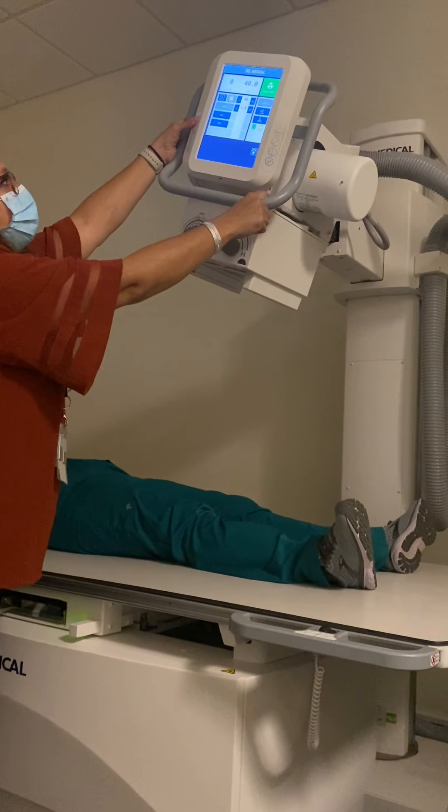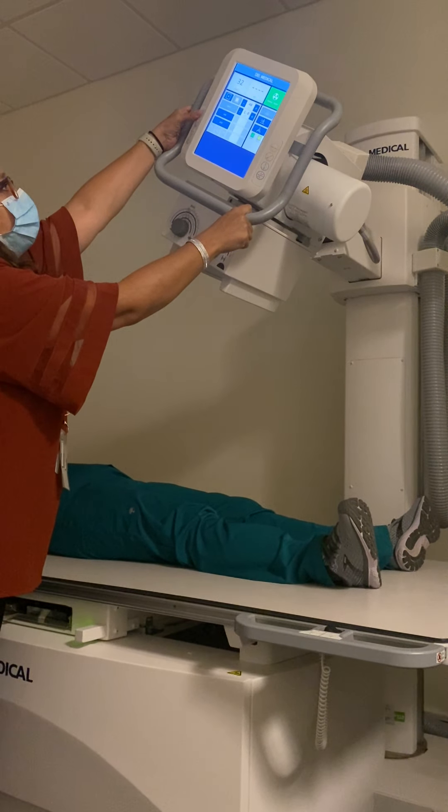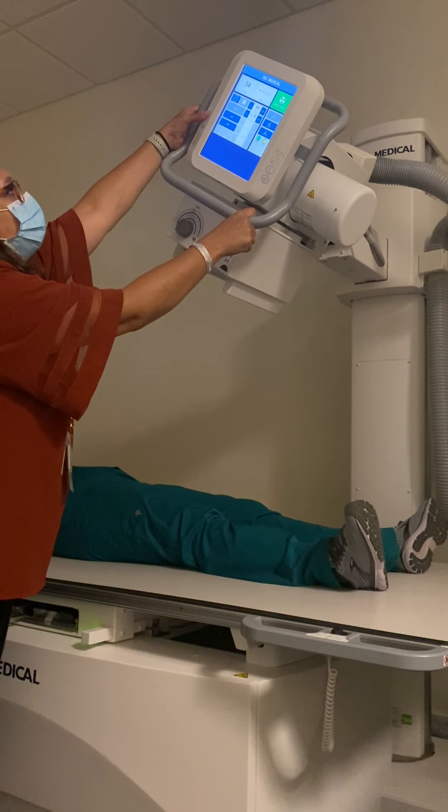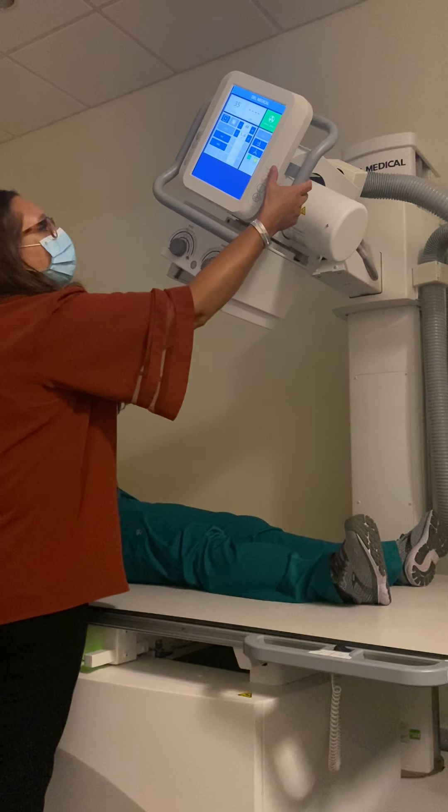For the AP, there is a 30 to 45 degree cephalad angle. Most of the time with men you'll use 30; with women you use closer to 45, but most facilities are going to stay right around 30 to 35 degrees.